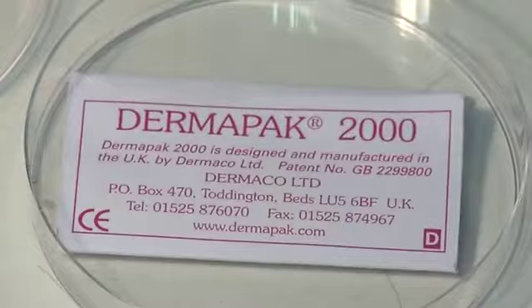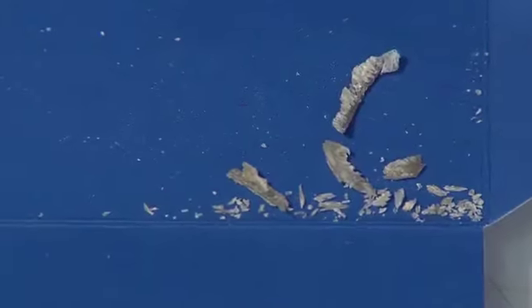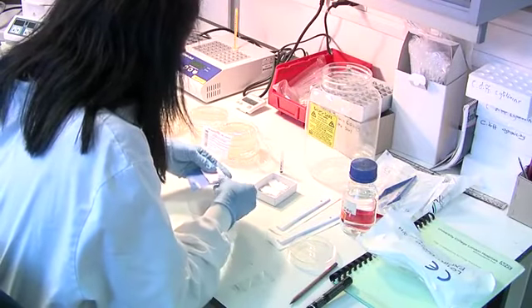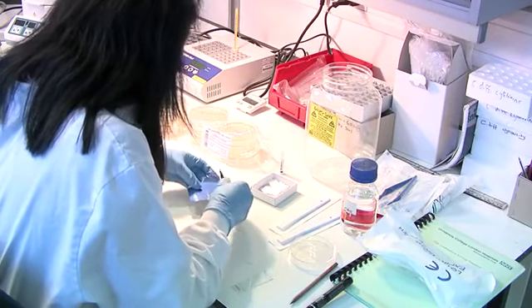and nails. Samples are best collected into folded squares of black card or paper to allow drying out of the sample to reduce the level of bacterial contamination and also to allow easy visualization. This sample shows toenail clippings and scrapings. The card is carefully opened by the biomedical scientist wearing gloves and protective eyewear.